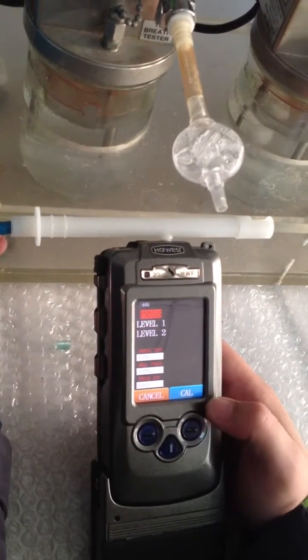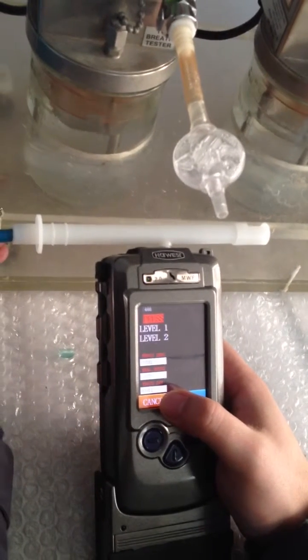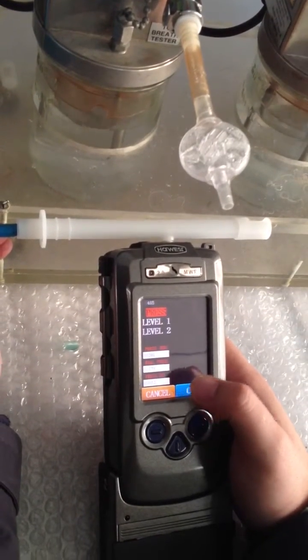Press the red button here. You will see the figure at the bottom line. If the figure is over 10, it means the pressure calibration is successful.